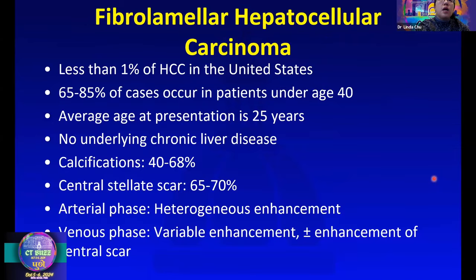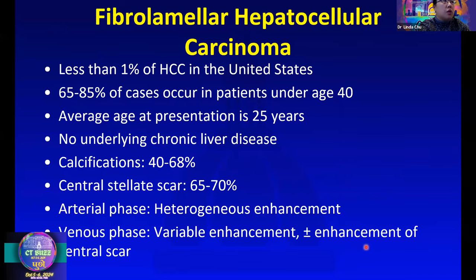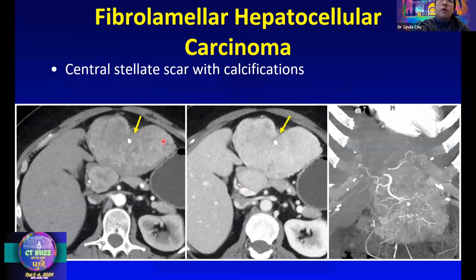I'd also like to mention a subtype of HCC called the fibrolamellar subtype. It's less than one percent of HCC in the United States, usually occurring in younger patients without underlying chronic liver disease. We see calcifications and a central stellate scar. On arterial phase, there may be heterogeneous enhancement, and on venous phase, variable enhancement of both the lesion and the central scar. Here's an example of fibrolamellar HCC — a heterogeneously enhancing mass on arterial phase with a central scar and calcifications. On the coronal MIP, you can appreciate tumor neovascularity with irregular feeding vessels, indicating an aggressive lesion.